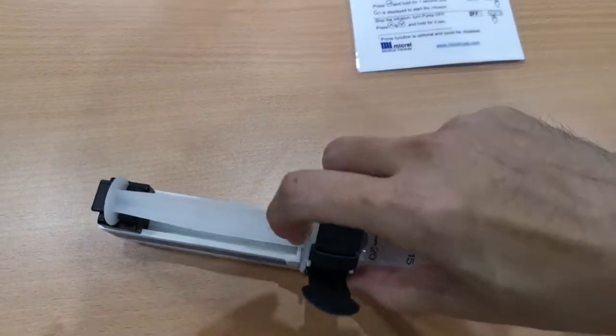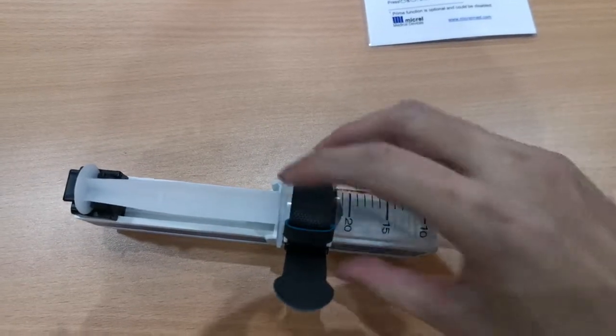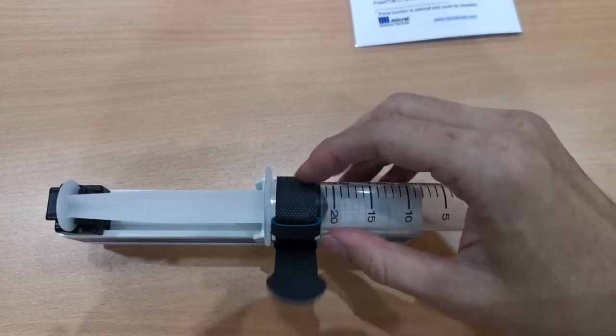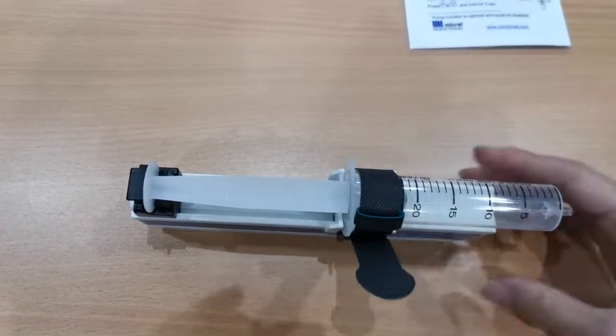Now there's a better upgrade. There's a belt thing, so it won't break easily. The time I'm using the string, just a tiny kind of wire, a cable attached to it. Then you can use different syringe sizes.